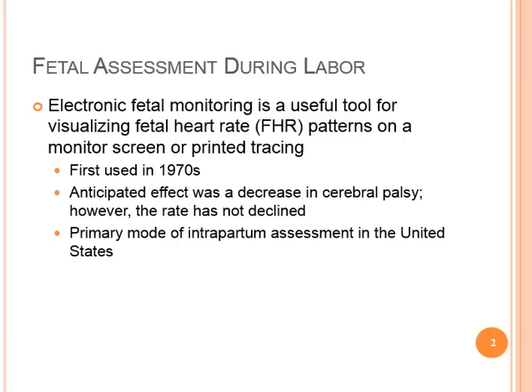Fetal Assessment During Labor. Electronic fetal monitoring is a useful tool for visualizing the fetal heart rate patterns on a monitor screen or printed tracing. Electronic fetal monitoring was first used in the 1970s. The anticipated effect was a decrease in cerebral palsy. However, the rate has not declined, and we associate that with the increasing rate of premature babies that are surviving now. Electronic fetal monitoring is the primary mode of intrapartum assessment used in the United States.